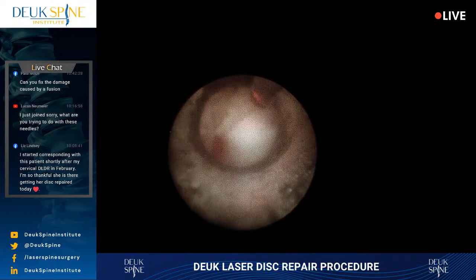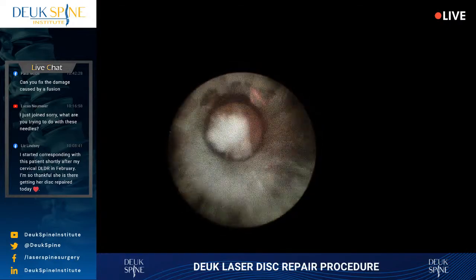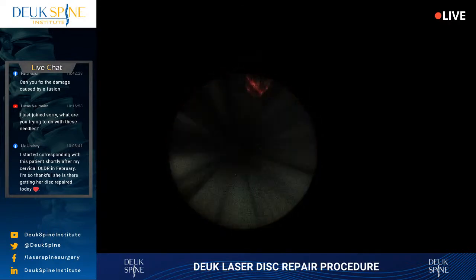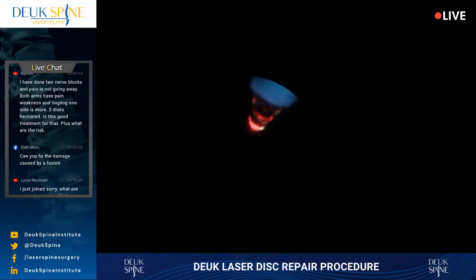All right. So. We have a question. Sure. Yeah. Can you fix damage caused by a fusion? Can I fix damage caused by a fusion? Usually not, if it's damage caused like by the surgeon during the surgery, but it's a very important question and a very complex answer. There's a herniation right there.